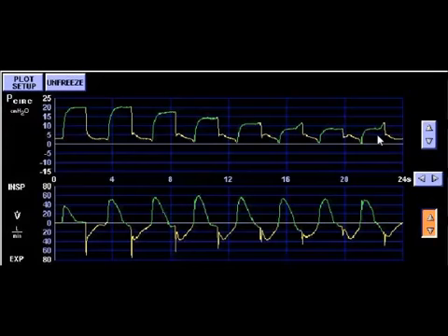So what you'll usually see happen is the stair-step pattern, and then they'll wear out, and then it'll go the reverse way. So this going up and down creates a lot of work of breathing and really fatigues the patient. Another thing, oxygenation-wise, is say you were at a higher pressure, this creates a higher mean airway pressure also.